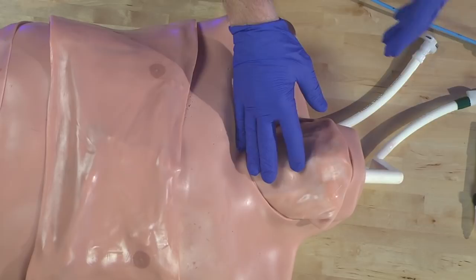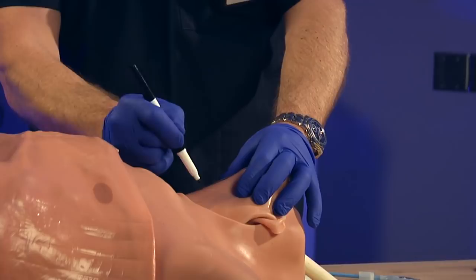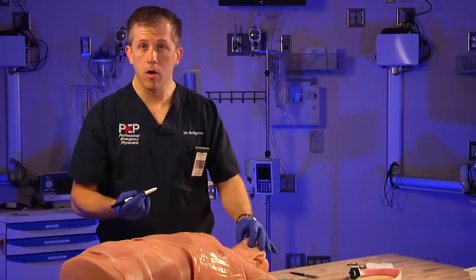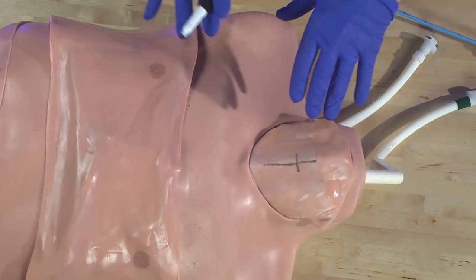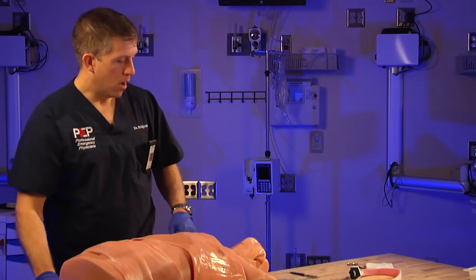Before I've even started, I get out a marker and make a vertical line from the thyroid cartilage down over the cricoid ring and membrane. Then I make a horizontal mark across the membrane — X marks the spot. That's where we'll make our incisions. Now I can step away with my equipment ready. In the difficult airway algorithm, if things don't go the way I want orally or with a non-visualized airway, I can immediately move to this procedure, already knowing where my landmarks are.